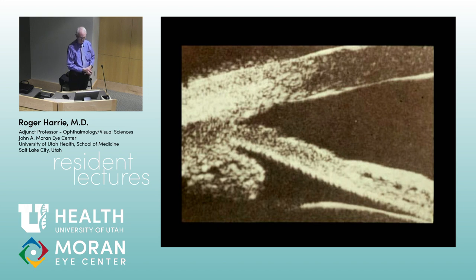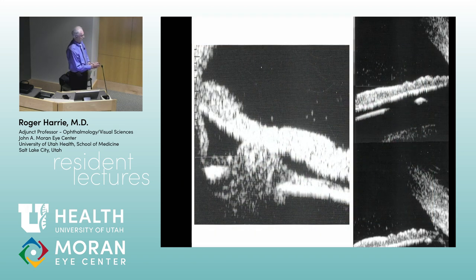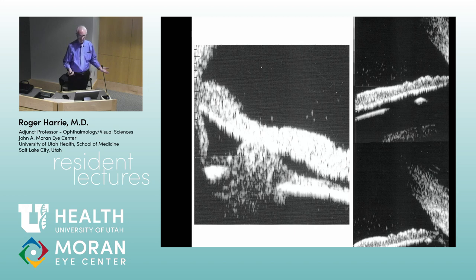At 50 megahertz, you can see incredible anatomy: cornea, iris, anterior lens, zonules, and ciliary body. Here's a cyst — pretty common, we see iris bulging and it's always good to do ultrasound to confirm it's not a tumor. Here's a case with Dr. Vitale of chronic recurrent post-cataract-surgery uveitis treated with steroids for about a year that kept coming back. On UBM you can see the cornea, iris, IOL, and a clump of material on the IOL — that's actually bacteria growing, P. acnes vegetation. The patient needed the lens and capsule removed to clear the infection.